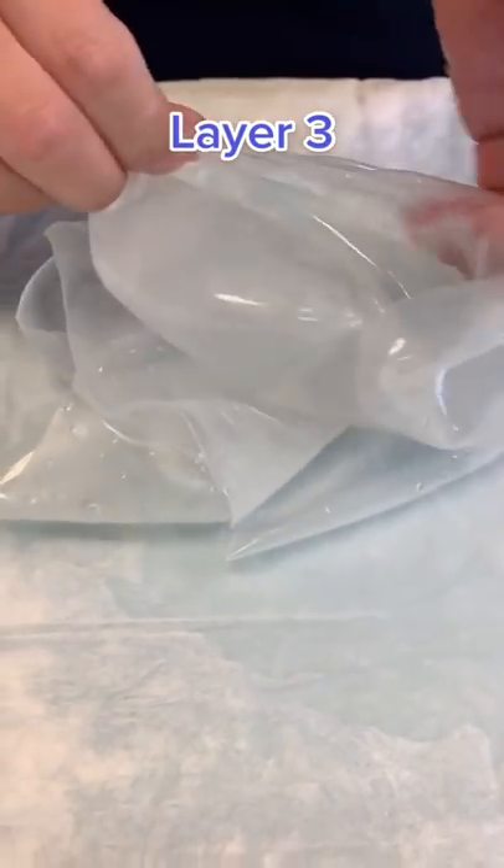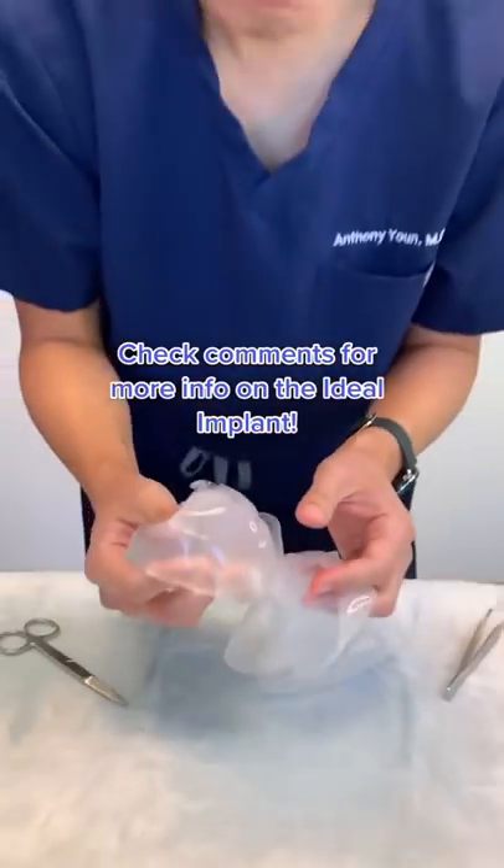Here is the next layer that I'm cutting through, and you can see here that is the innermost chamber. There's no implant like the ideal implant.